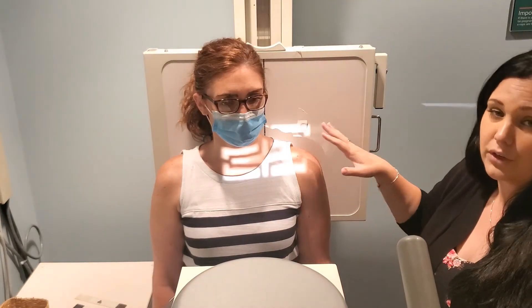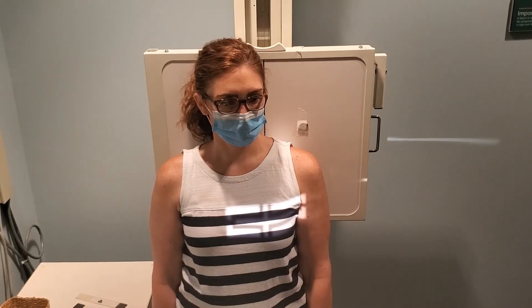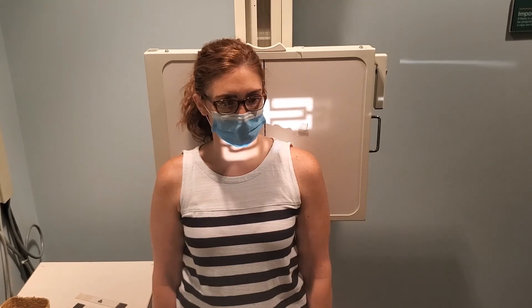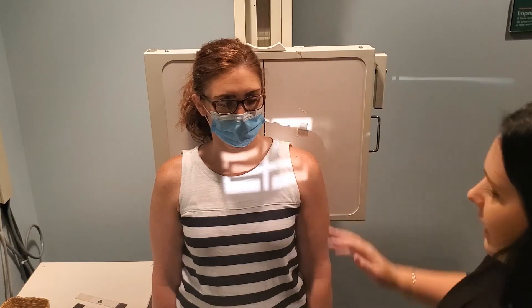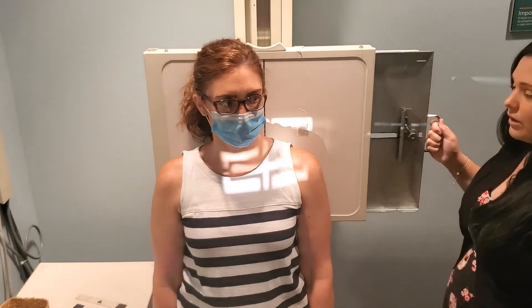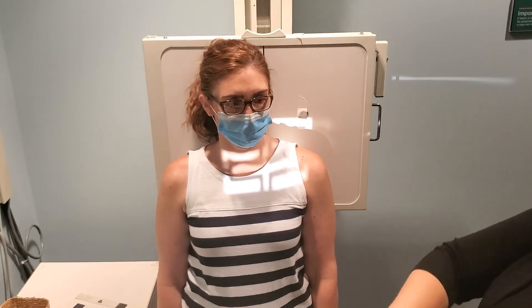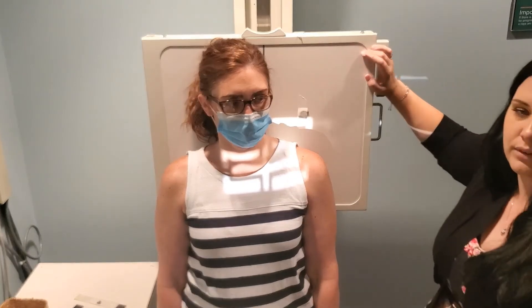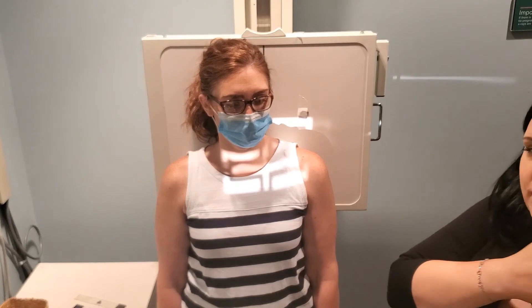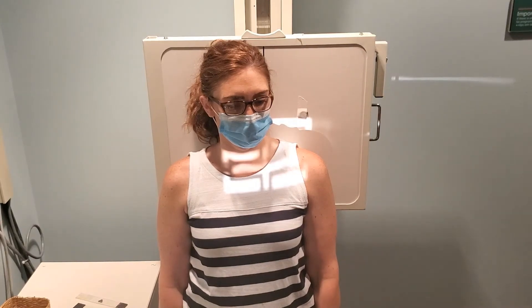Leave the patient in place and go straight to the axial — put a 15-degree cephalic angle on your tube. Suggest moving the tube down before angling it up so you don't blind your patient, but you can warn them as well. From 90 degrees, go to 105, and center to mid-clavicle. The patient shouldn't need to shift much. The key thing students forget is that once you add an angle to the tube, the bucky is no longer aligned — you must move it up. Body parts travel in the same direction and at the same angle as your CR. The clavicle is projected upward at 15 degrees intentionally so you can see it more clearly, free of superposition from the ribs and upper chest structures. Realign your bucky or you might miss your image.